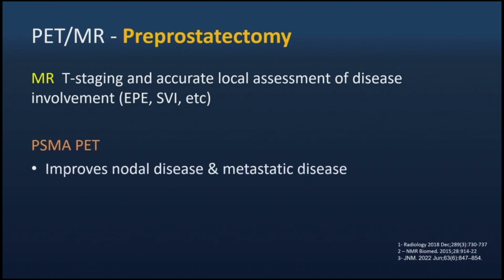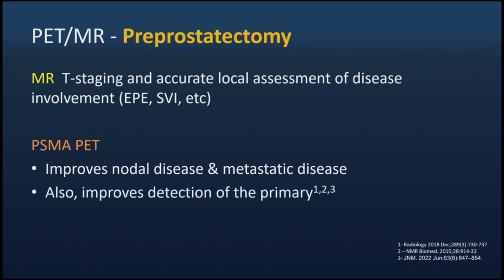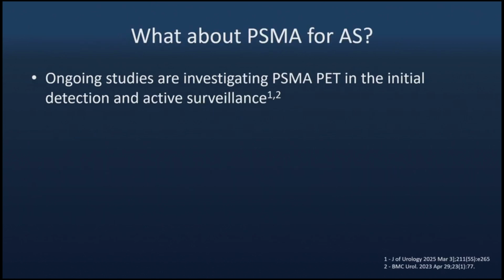Why? Well, great for improving nodal and metastatic disease. And on top of it, there's a lot of data that's supporting the fact that it's actually as good, if not at least complementary to the MR for detection of the primary.